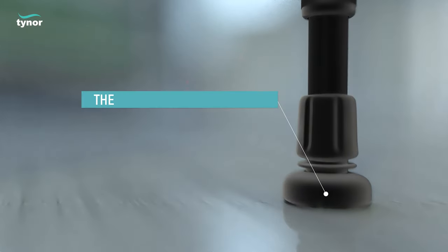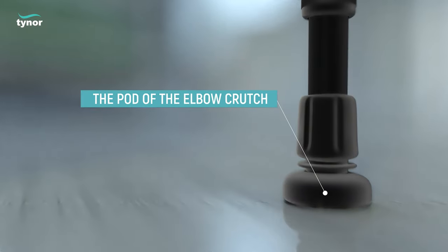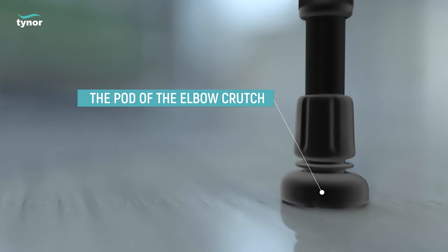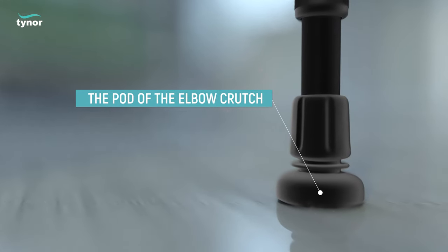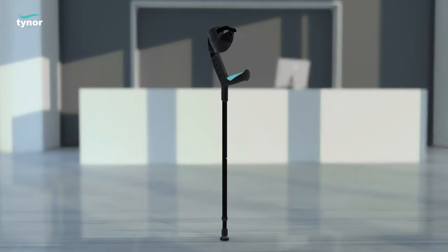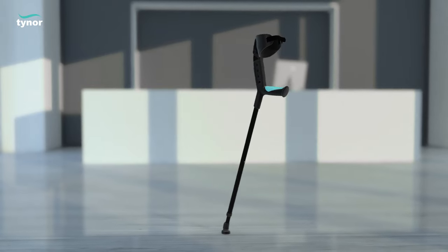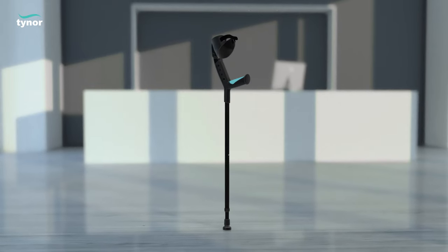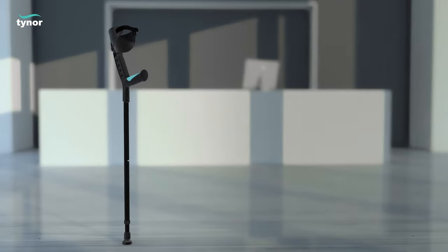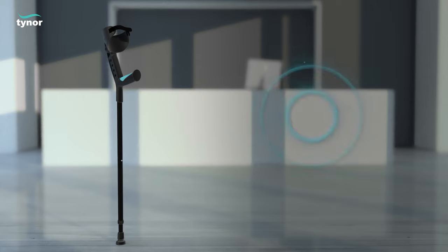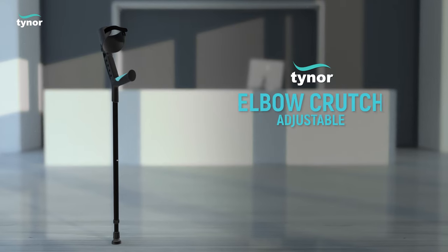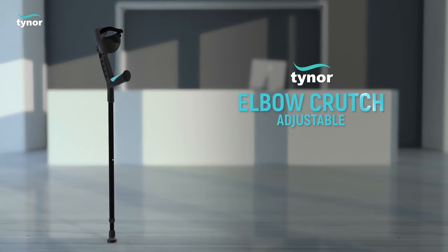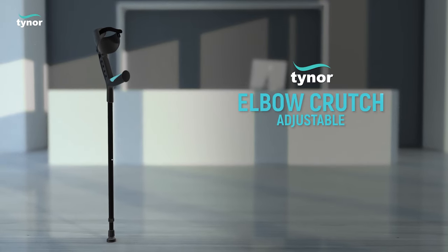The pod of the elbow crutch is made of anti-slip grade polymer. The design of the pod gives 100% surface grip which increases stability. All these excellent features make Tynor's elbow crutch adjustable the best suitable option available to you.